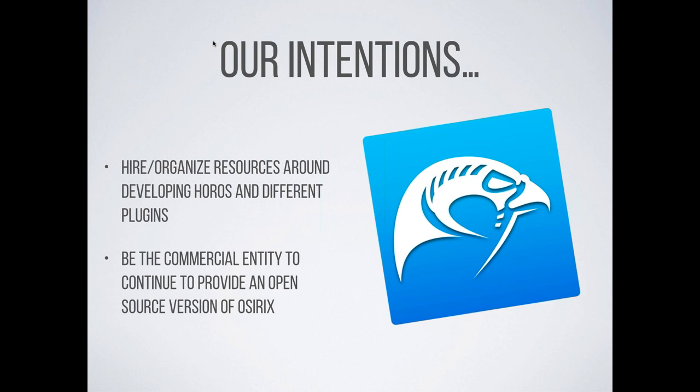And that's okay. Look, I'm not out there to grind my axe, nor is Purview, the company, against this. We simply are looking, most importantly, at ways to continue the open source version, if you will, of this great medical image viewer.